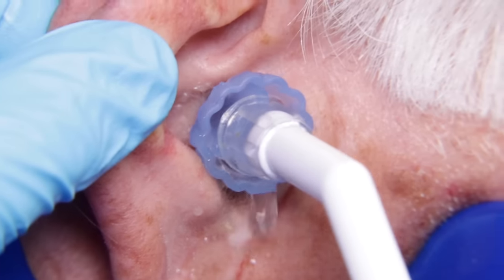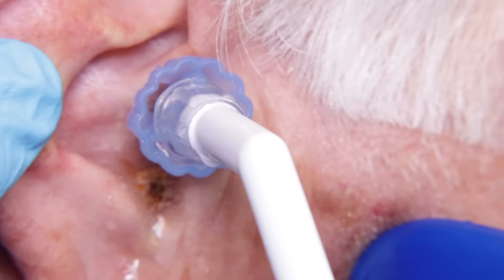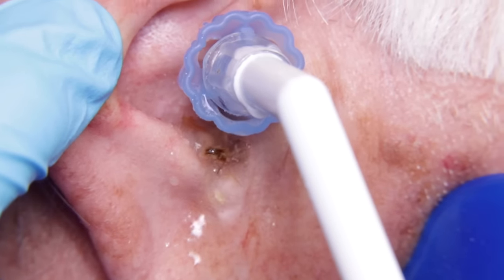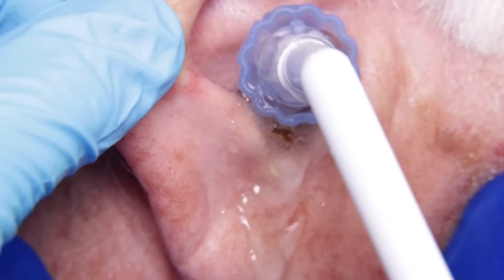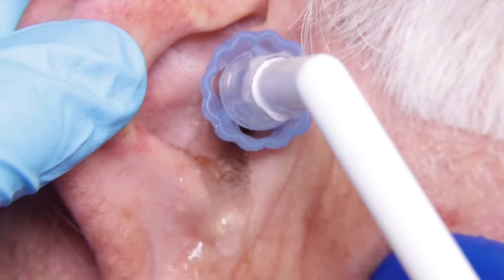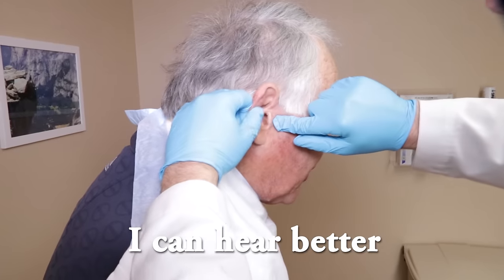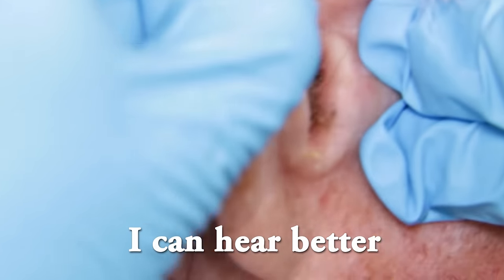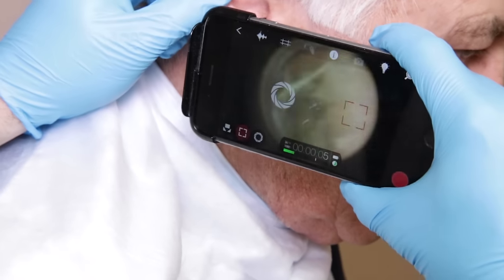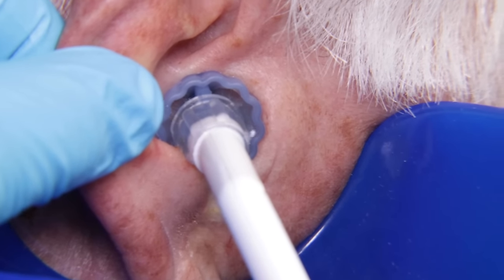See how there's some coming out? It's coming out, Gary. It's starting. I can hear better. Already? So that means we should take a look at it. This is after the third wash in the right ear — it's different, something's coming out. Four times — this is a record for this office.